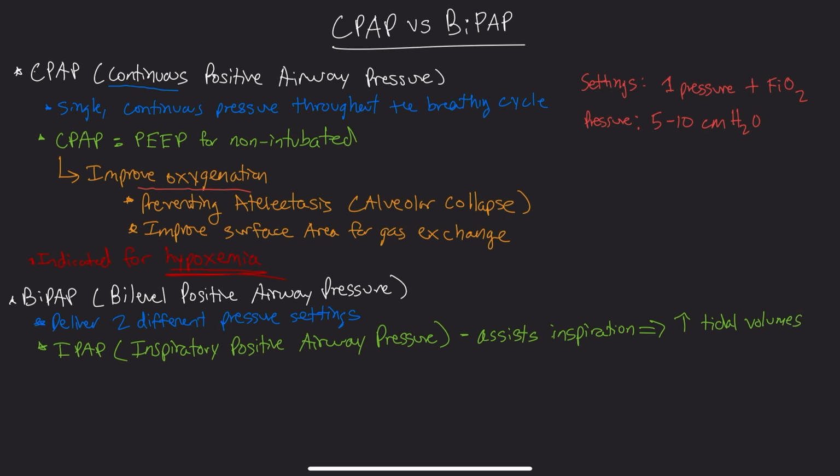Okay, the other setting is expiratory positive airway pressure, or EPAP. And you can think of this as PEEP. So very similarly, right, what does PEEP do?